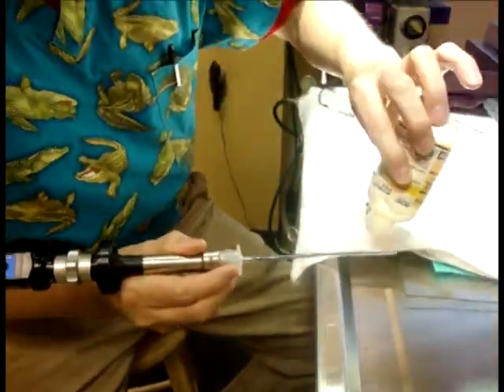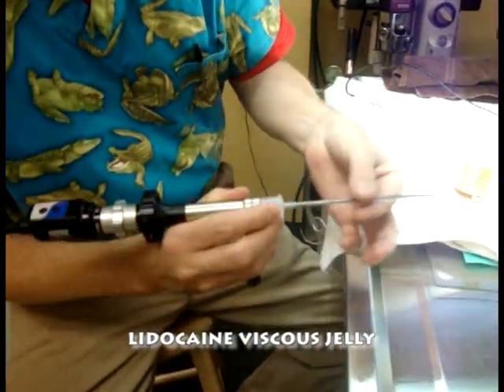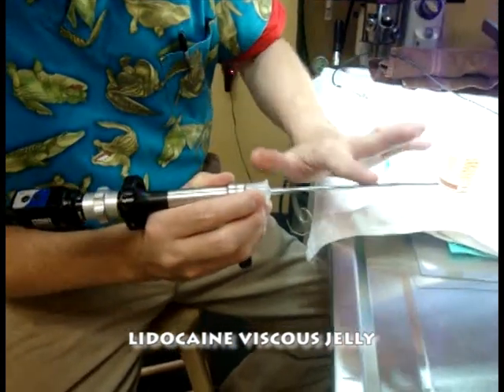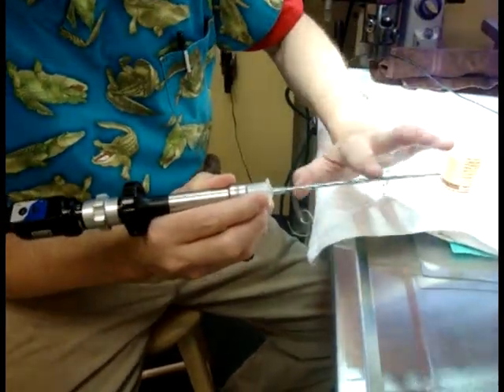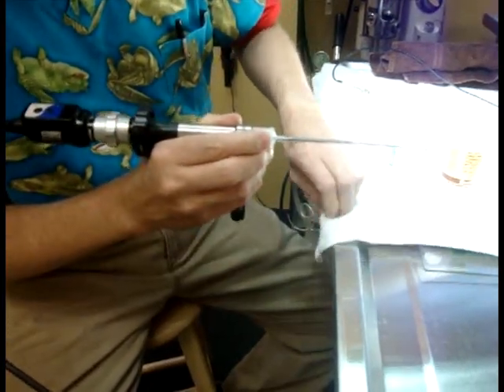I typically do use some viscous lidocaine jelly on the tip of the tube, not only to anesthetize the glottis, but also to make things slide past the teeth through the oral cavity. It's quite small, and this lubricant will help things pass without much friction.